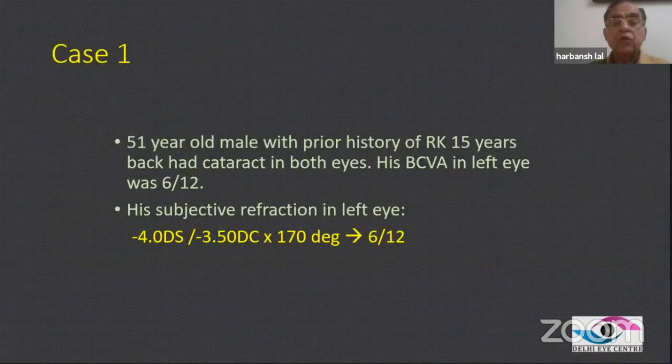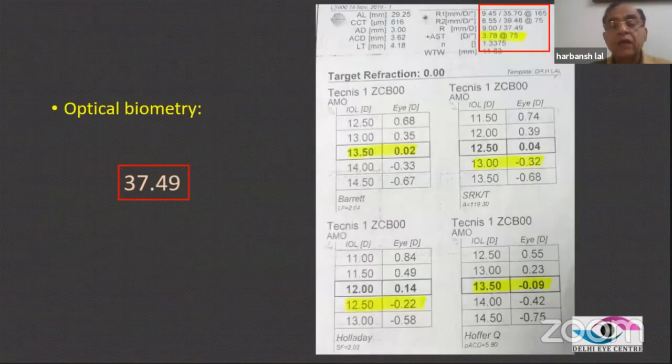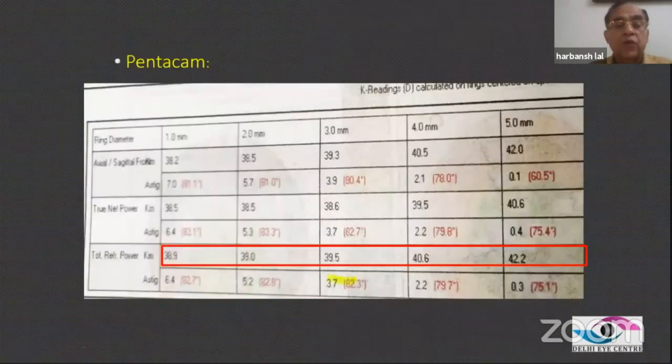This is a 51-year-old male with a prior history of RK 15 years back, had hard cataract in both eyes. His best corrected vision was 6/12. His subjective refraction was -4, -3.5 at 170. And once we did the biometry, we can see that the IOL power we were getting was 13.5 and the keratometry average was 37.49. But on a Pentacam, the keratometry was 39.